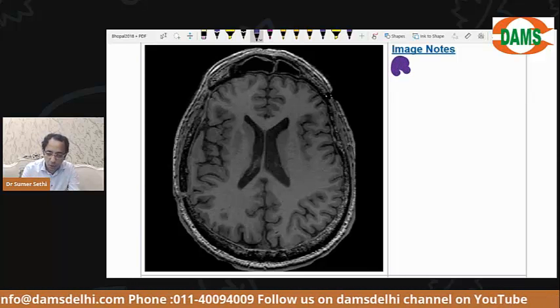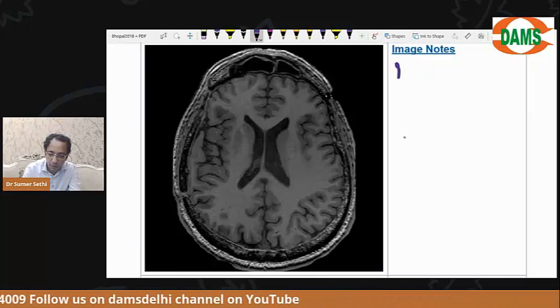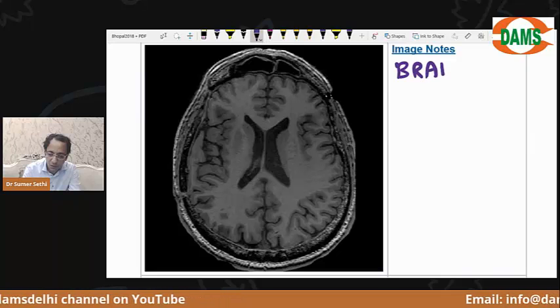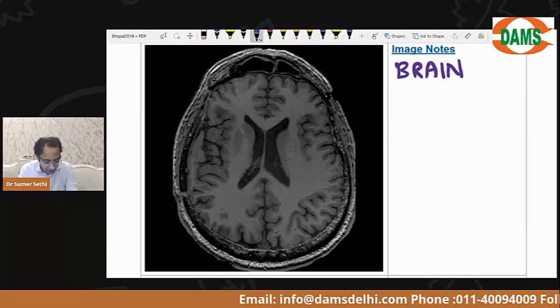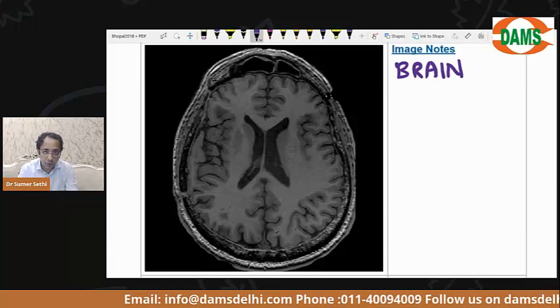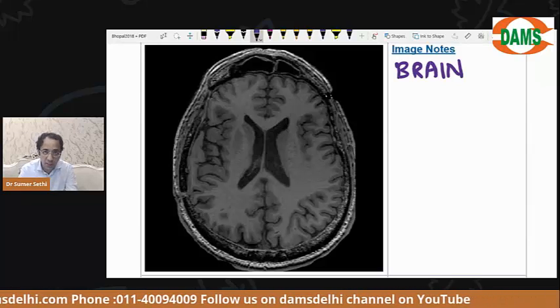I am so happy to see that most of you are able to tell me. I was thinking you will say abdomen, but this is brain. Very good. This is brain. Now tell me what section of brain is this?